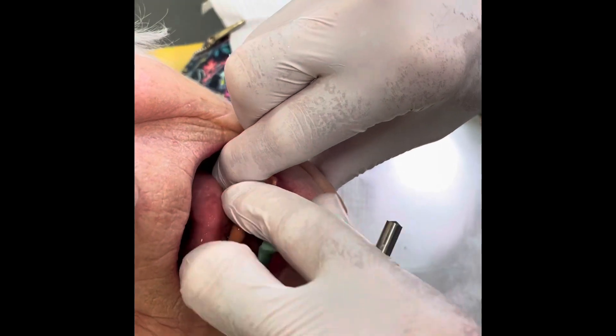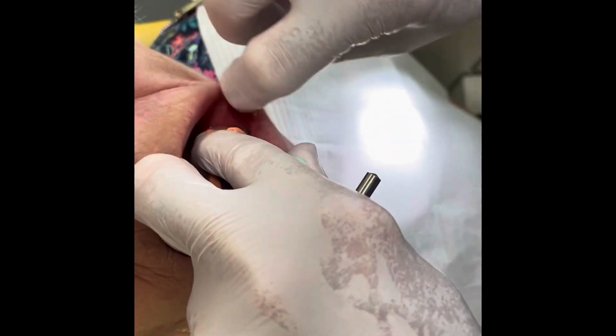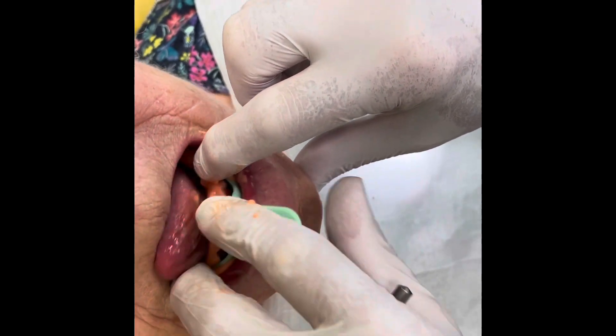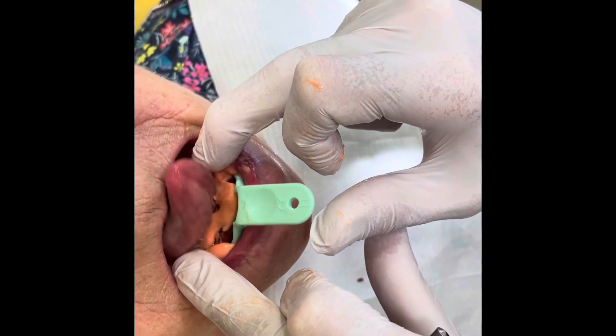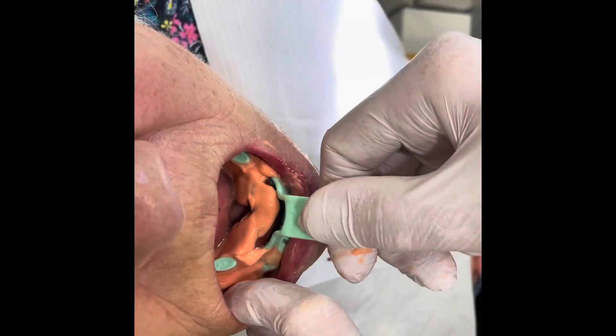Fingers on the top. Hold the tray down — you're pulling the excess material around the edge of the tray, you have to hold the tray down. Stick your tongue out, lick your top lip, left or right. Hold the tray down. Let your face go slack. Never let go of the tray. Tongue out again, left or right. So when it's set, you just take it out.